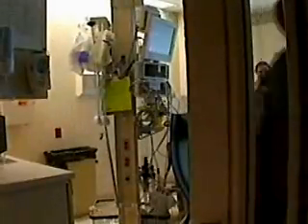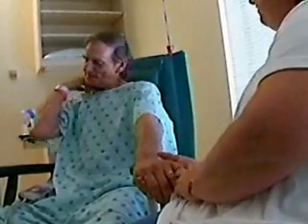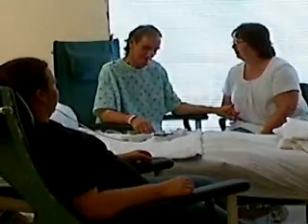Hard to breathe. Couldn't walk probably from here 50 feet without being out of breath. Willie lost his father and brother to lung cancer, a lifelong smoker himself. I was scared. Dr. David Wilson says traditionally when an x-ray shows a suspicious area, there are three options: a tissue biopsy, which is a lot to go through for what ends up about 40% of the time being a benign, non-cancerous nodule, a needle biopsy with a 30% risk of a lung collapse, or watch and wait. And with that, yeah, a little dark cloud just following you. And I was glad that he had the tool to work with.